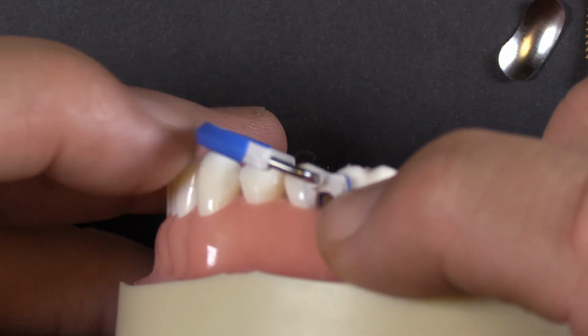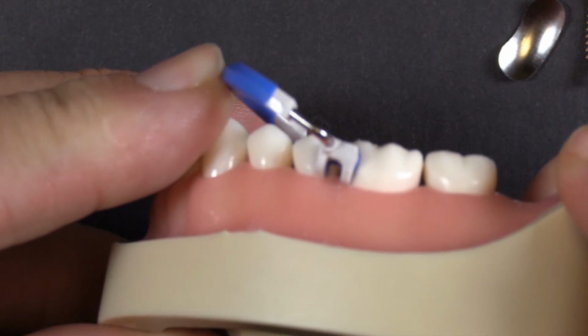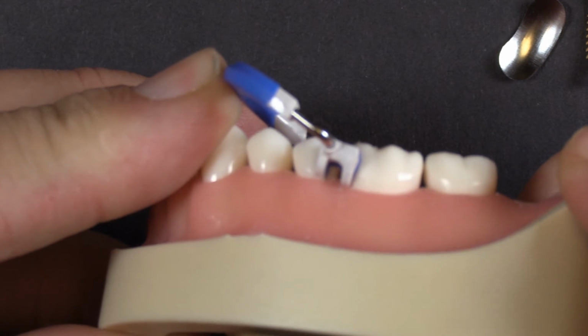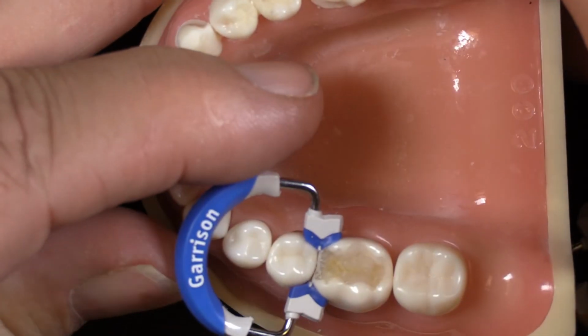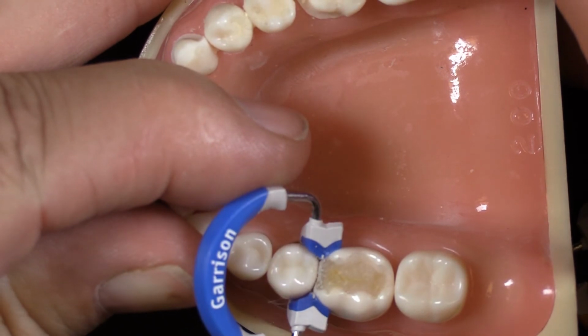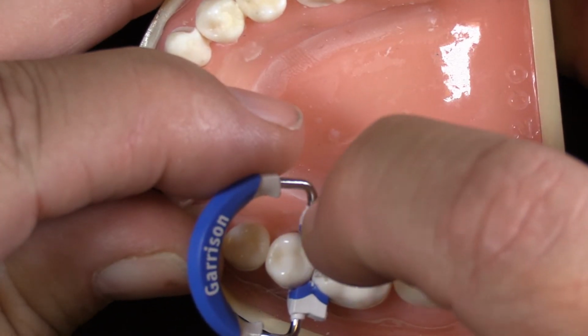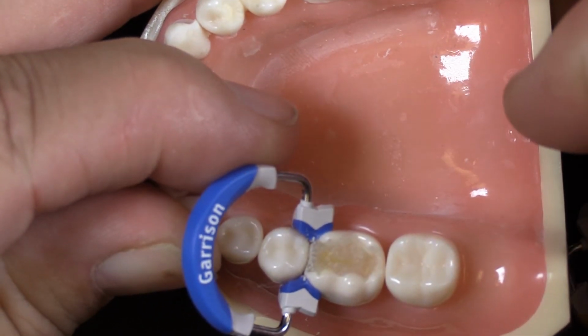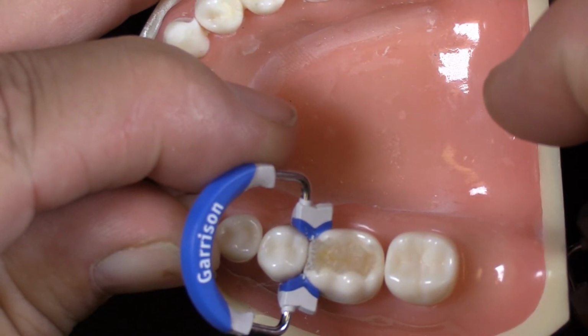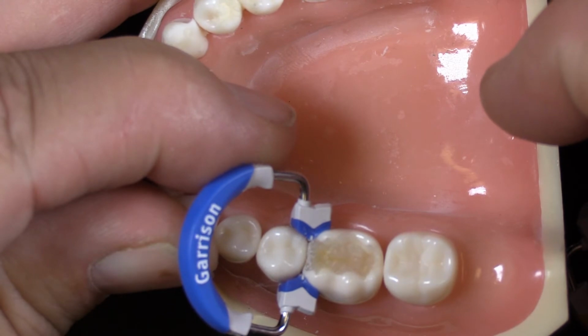So if this were lower here and higher here, what happens is this wants to set like this, and just on the occlusal angle here, if you tip this up, it is not holding very well. If you were doing a DO on that one, you're not going to be holding that band as nicely up against the tooth.